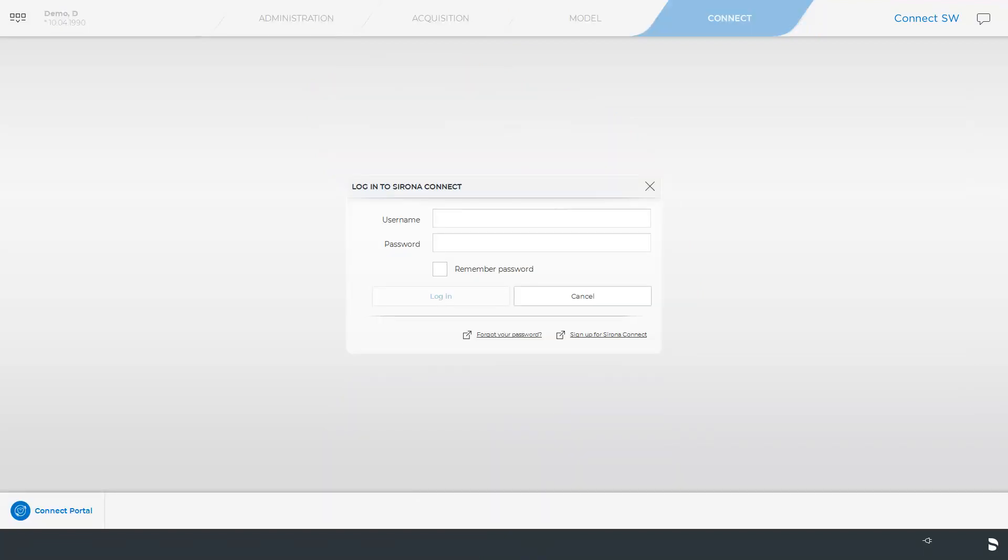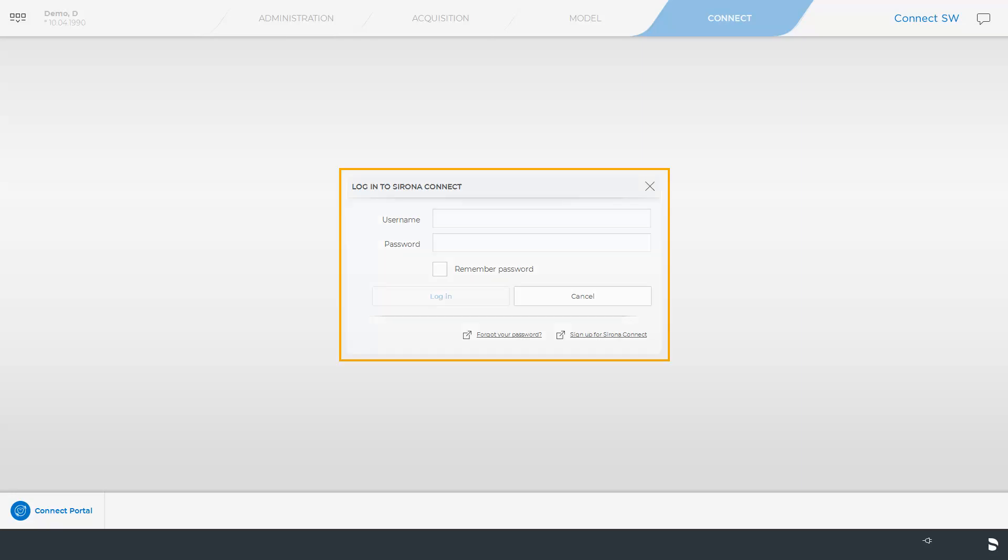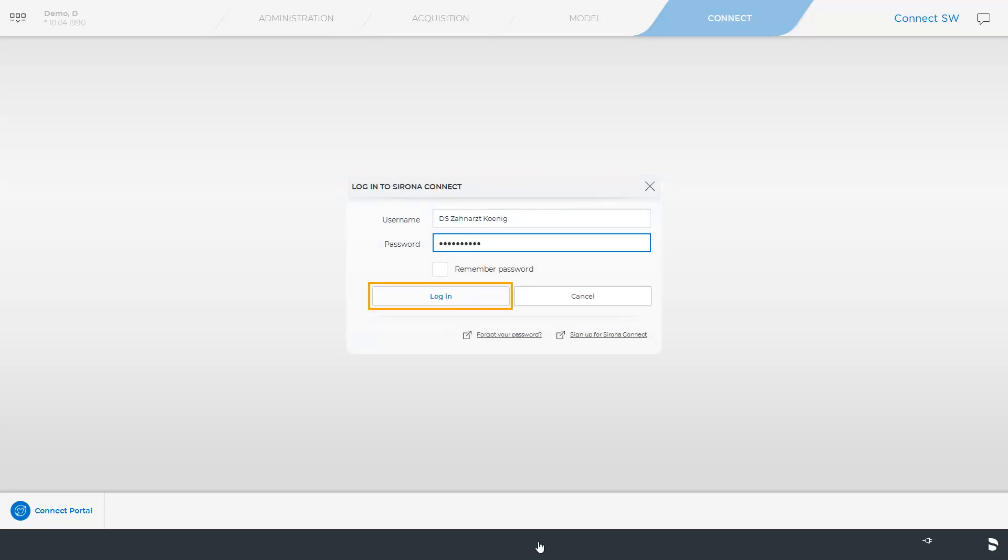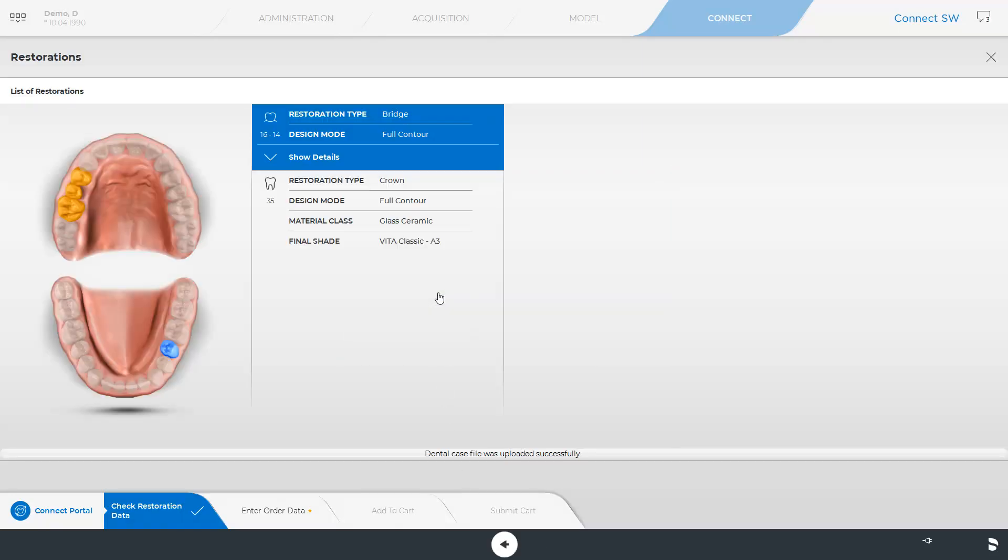To be able to send case data through the Connect Case Center portal, you and the receiving partner need an internet connection and a Connect Case Center customer account. Detailed information on how to register can be found in our video tutorial on the topic of Customer Registration in the Connect Case Center portal. Here, we will enter our username and password and click on Login.